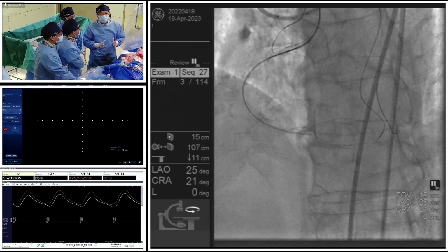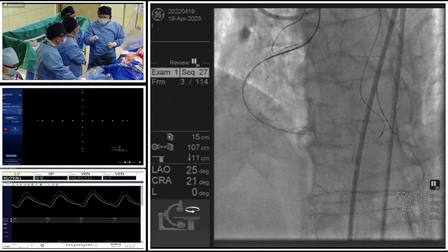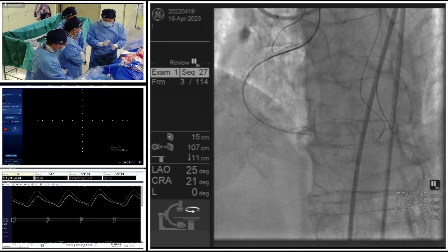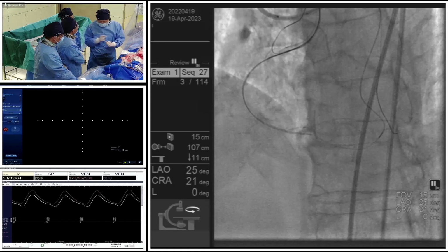The key point is to keep the Finecross microcatheter stable. And after the workhouse wire reaches the tip of the microcatheter, we can feel the absorbable suture already pushed out of the microcatheter, and then pull back a little bit the Finecross microcatheter, and then push another silk suture.